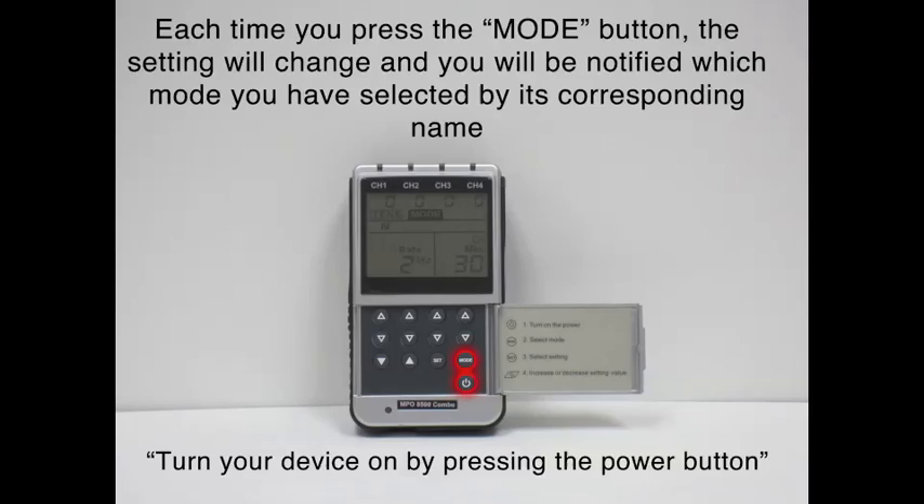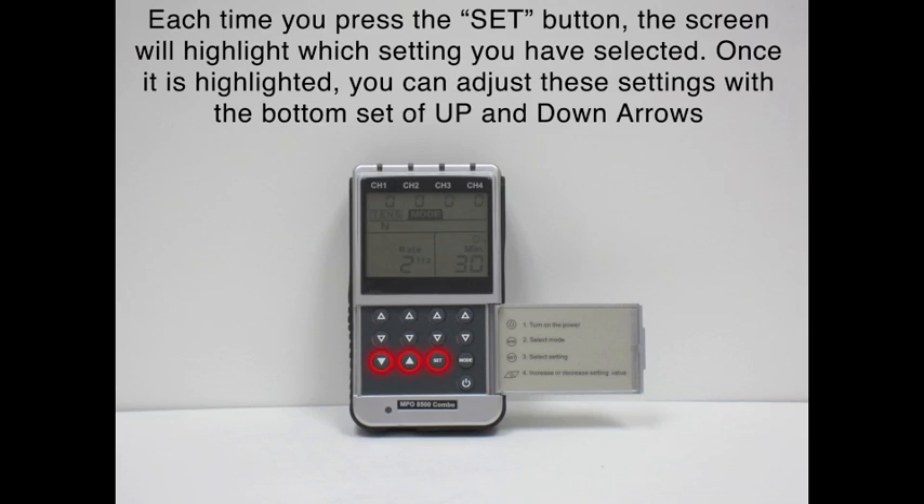We are going to turn the unit on with the on button. Now we are going to scroll over with the mode button to synchronous EMS. Synchronous EMS will allow two channels to go on while two channels are off and then alternate back. In the synchronous mode, we are going to press the set button, and we will notice that there is a ramp. The ramp is when the impulses start from zero and then gradually build to the desired impulse setting that we want.